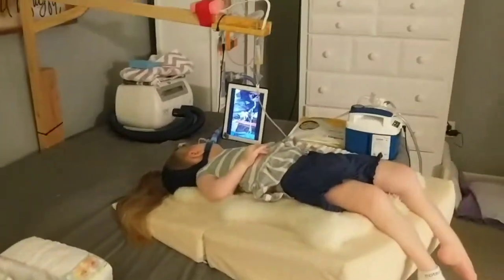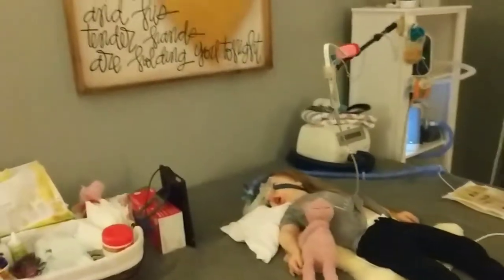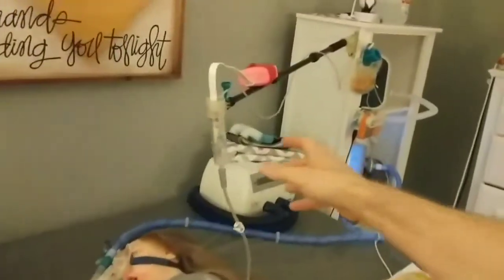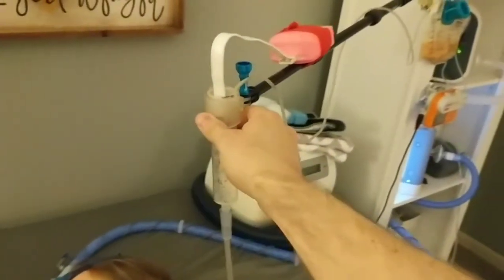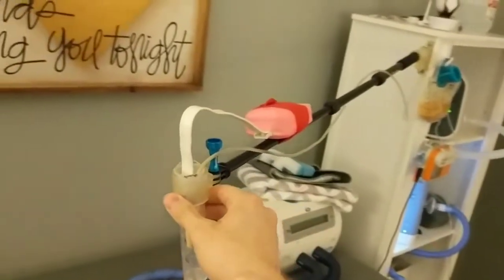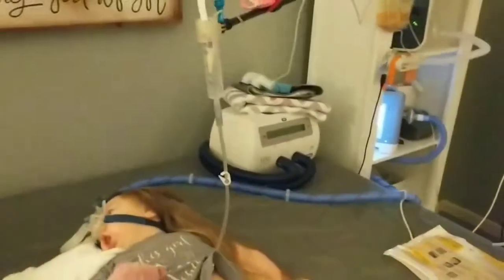So this is the new one. You can see it opens up a lot of space — no more big arm. Since this is now movable, we can move her wherever she wants in the bed. It will retract, extend, and pivot. It's attached to her so I don't want to move it too far, but now she can be wherever she wants in the bed.